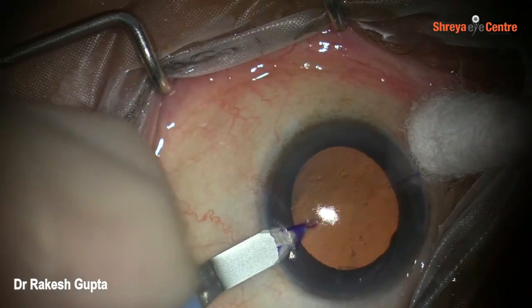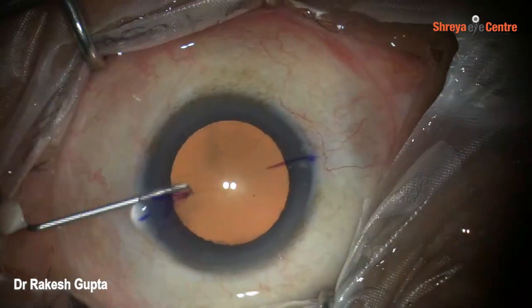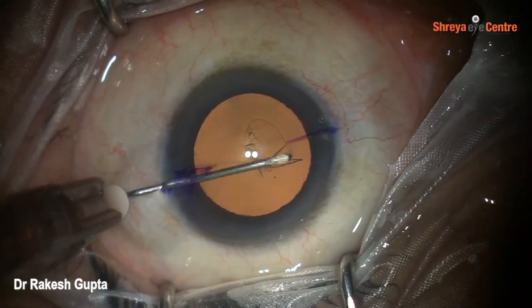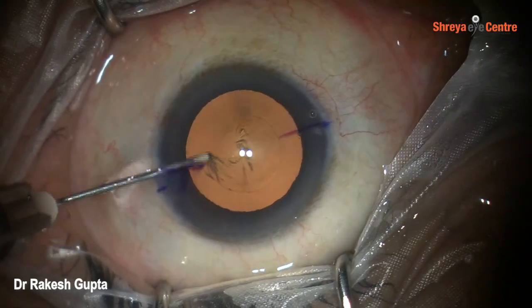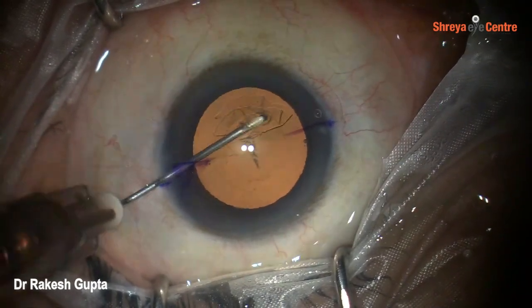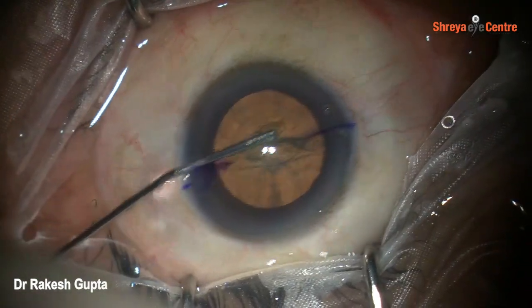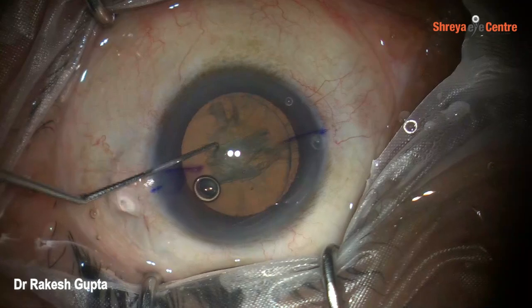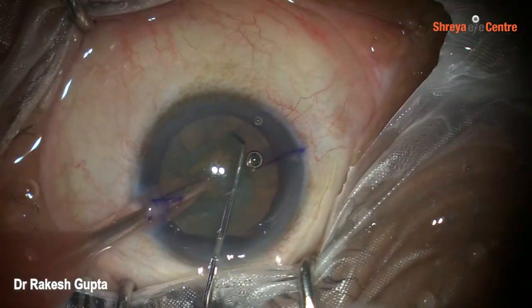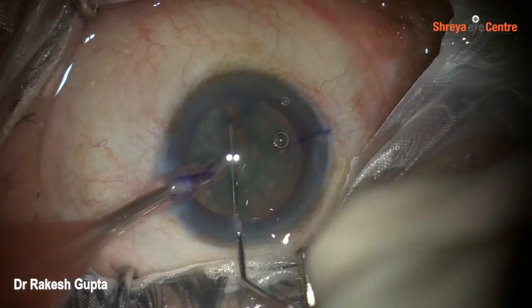Friends, complications do happen when we expect them the least. This is an interesting video which shows how a simple looking case planned for Toric Panoptix trifocal IOL developed posterior capsular rent and turned out to be a big challenge to me. Though posterior capsular rent is a common complication, when you're planning for Toric Panoptix IOL, it becomes a very big challenge because we don't have to manage only PCR, but we also have to implant the promised intraocular lens to the patient.